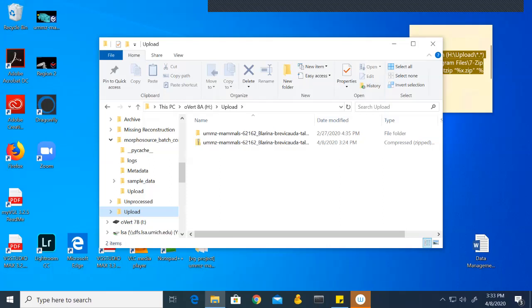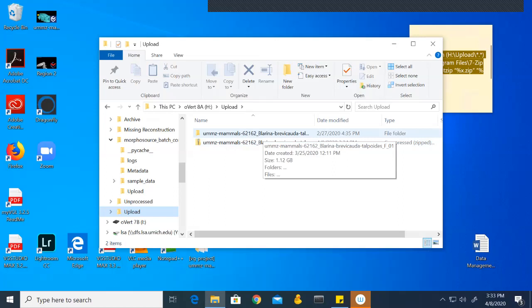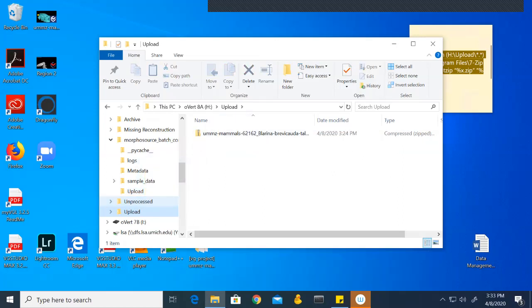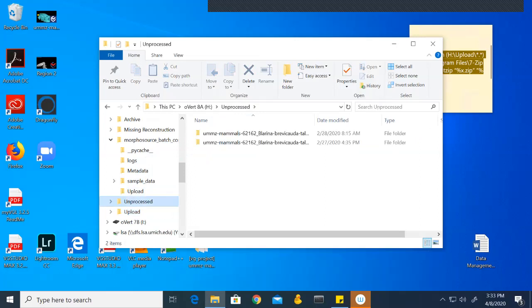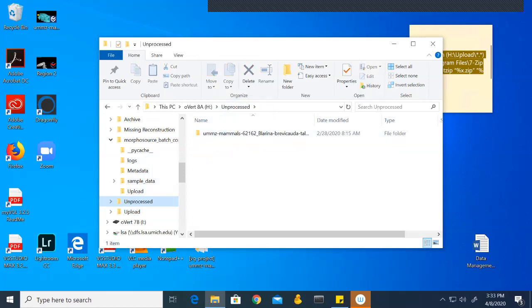Once it is finished compressing, we have this zip folder here. We need to put this original file back into where it came from. I'm just going to click and drag it back to unprocessed, then go back to unprocessed and drag that folder into the original folder it belongs in. Again, you would be doing this manually for every specimen you have.